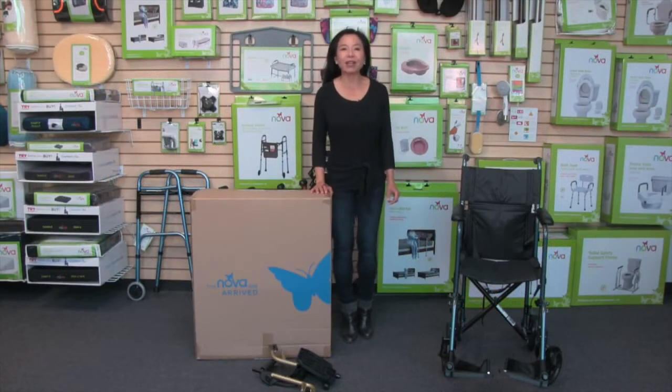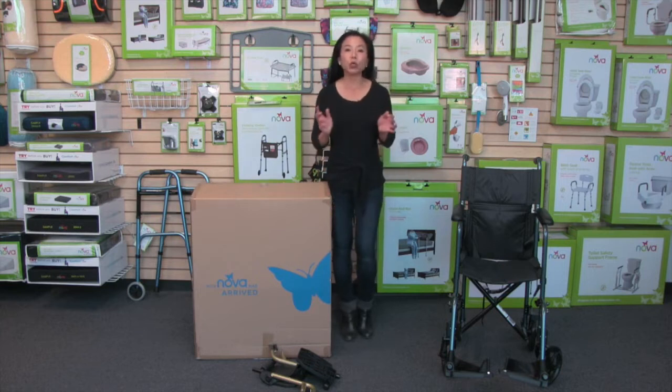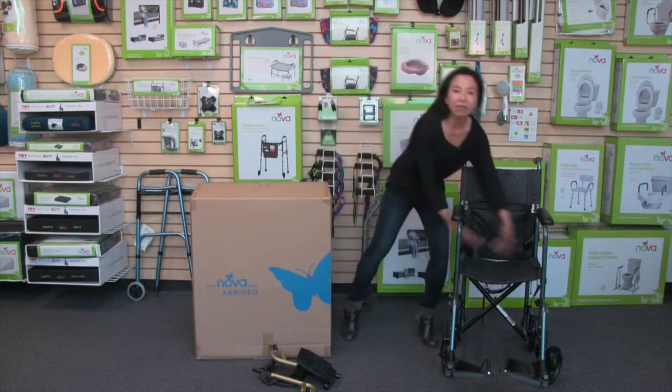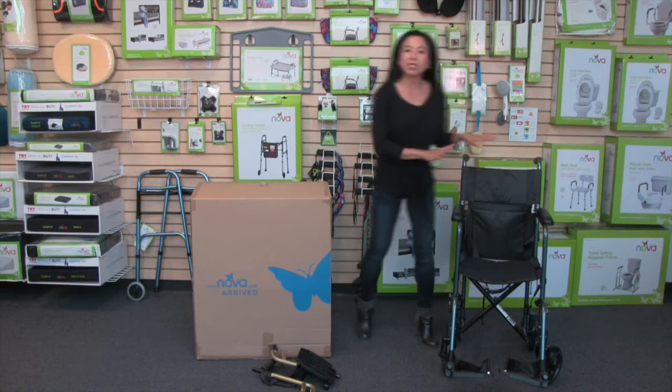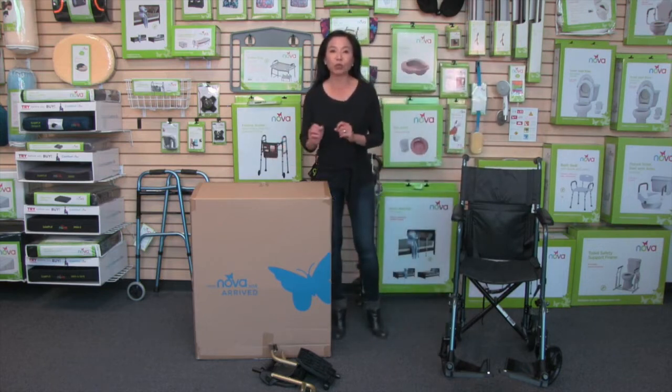This video is about the Nova lightweight transport chair. This transport chair comes in two widths: the 17-inch seat width, which is the 327, and then the 19-inch seat width, that's the 329.